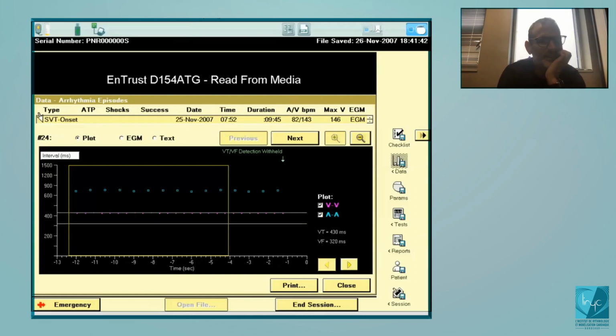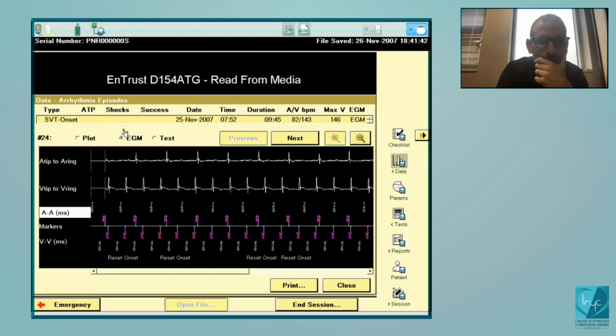And you see here that what is most likely is that it is clearly a VT, and we will check after with the EGM, but it's clearly a VT. But probably there has been a sudden acceleration, but just slower than the tachycardia, and then there is acceleration of the VT, and then you reach the zone of the ventricular tachycardia. So when you compare, there is for the device no acceleration because you are just at the limit of the tachycardia zone.